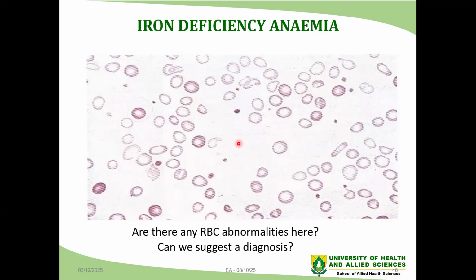This patient seems to have quite a number of things. That would say that the person will be having multiple pathologies as well. But then when we look at the morphology here, it is likely the patient also has pronounced iron deficiency anemia. But of course, when it comes to diagnosing iron deficiency anemia, we can't use just the blood film alone. We need to go on and do some chemistries, do the ferrogram to be able to confirm to us that the patient actually is iron deficient.